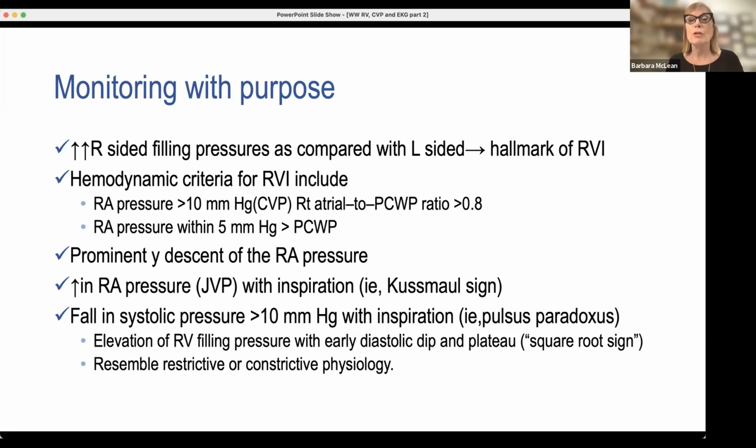I want to remind you that I might only have a central line. I don't even have to be in the ICU. I could be in the ECC. I could be in the step down. I've got a central line. You put that central line in, it belongs to me. That brown lumen, I'm going to attach to a stopcock, pressure tubing, pressure bag, and I'm going to monitor.